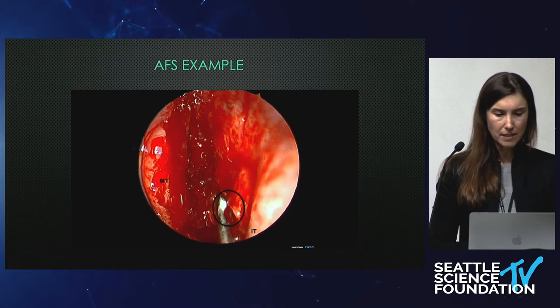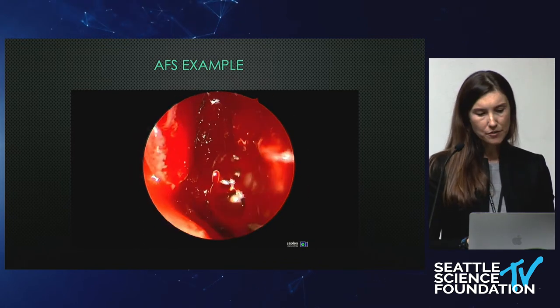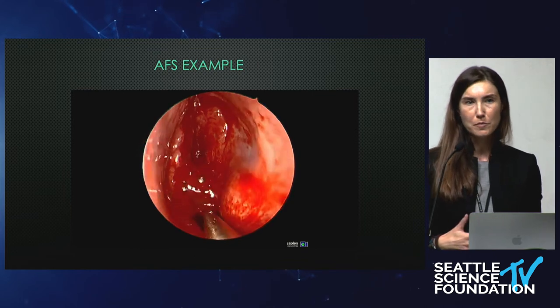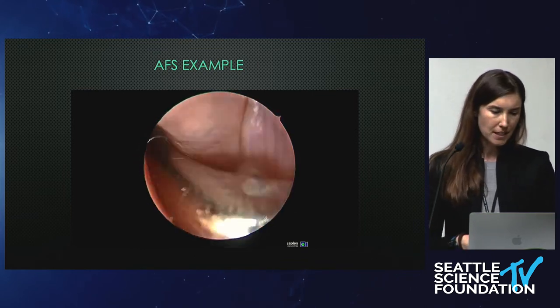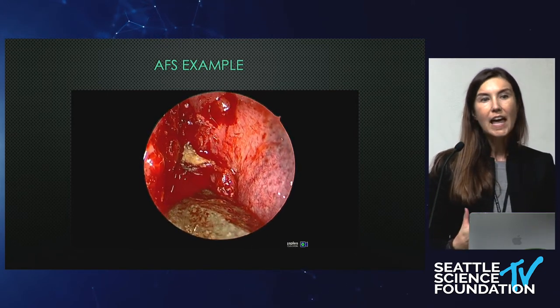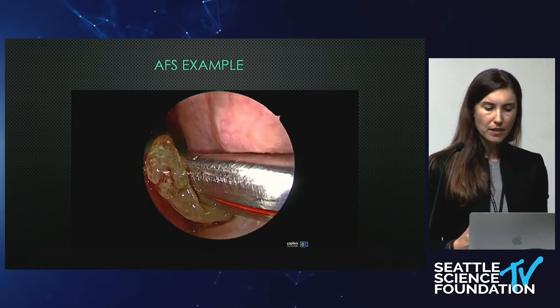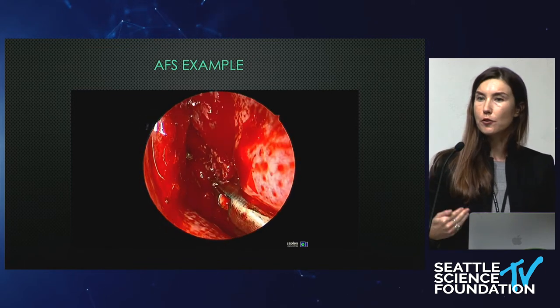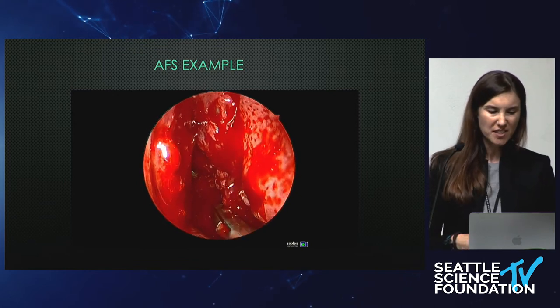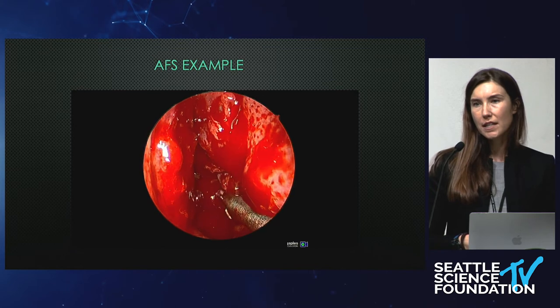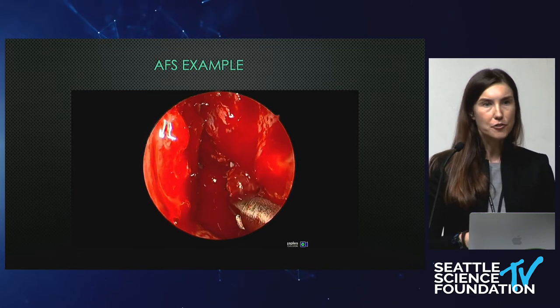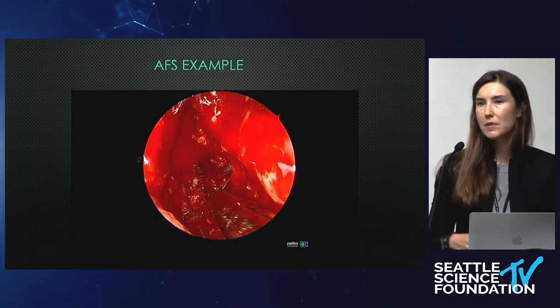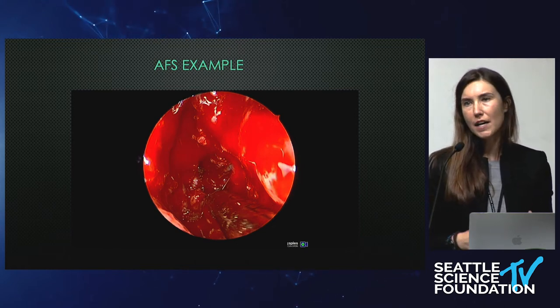We're in the posterior one-third of the inferior turbinate — this is that posterior fontanelle. We're pushing down and back to open into this area. As you saw in the scan, this is going to be filled with thick allergic mucin — that peanut-butter consistency material. Once we take some of that out, we can see the cavity of the maxillary. You want to see the cavity before you start using any powered instrumentation. Then we're taking a backbiter, coming forward to take out the uncinate completely — you can see that this is thickened bone with polypoid tissue, having become neo-osteogenic from chronic inflammation, which is very common in these allergic fungal sinusitis patients.